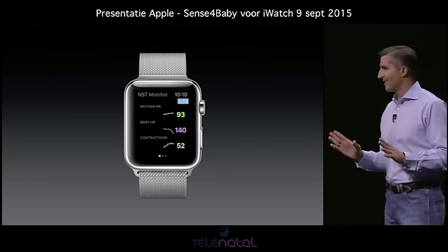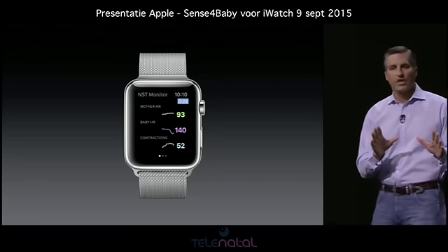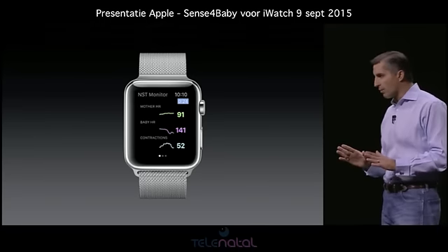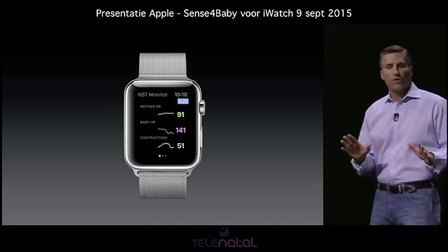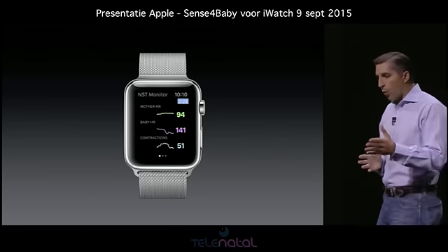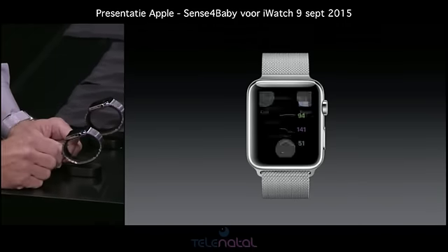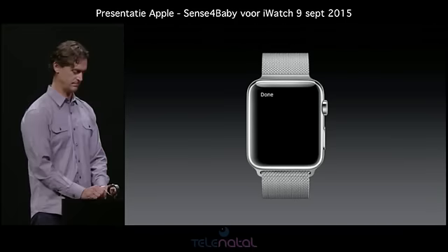So finally I can differentiate between the mother's heart rate and the baby's heart rate, which has been a problem for many years with home monitoring. Now, while she's doing this test, she can actually listen to the baby's heart rate right on her wrist.